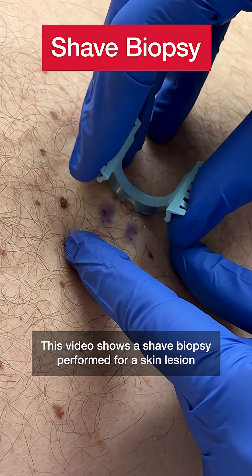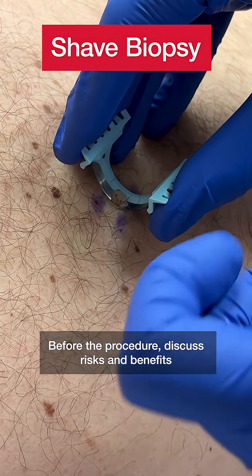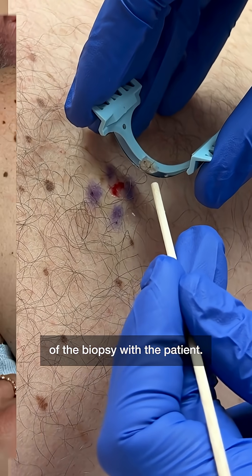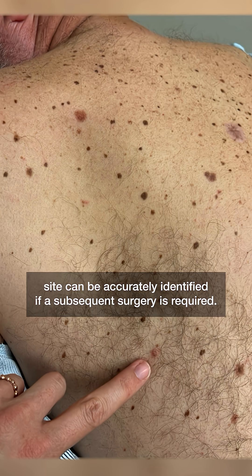This video shows a shave biopsy performed for a skin lesion suspicious for skin cancer. Before the procedure, discuss risks and benefits of the biopsy with the patient. Take a photo of the biopsy site, including anatomic landmarks, so that the biopsy site can be accurately identified if a subsequent surgery is required.